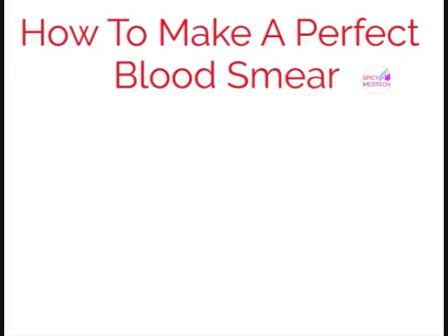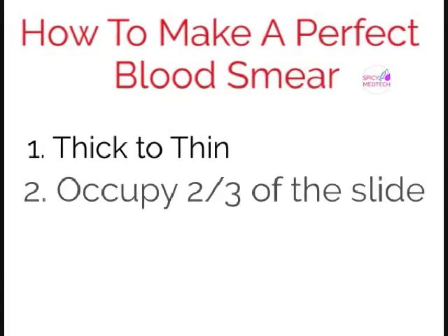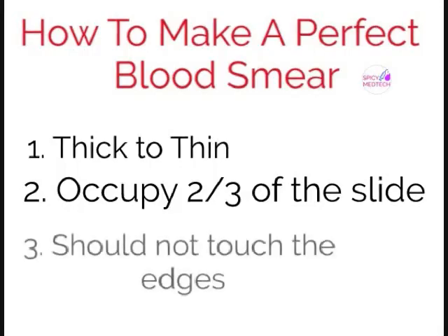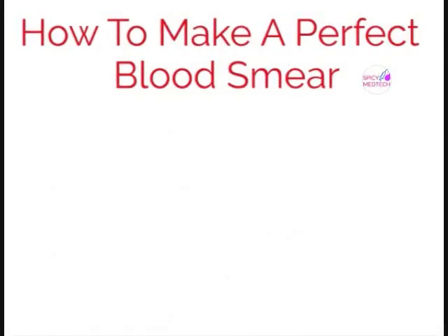So what makes a blood smear desirable? First, the smear should have a gradual shift from a thick film to a thin film. Second, it should occupy two-thirds of the slide — anything more or less would make it undesirable. Third, it should not touch any of the edges of the slide. And lastly, there should be no holes.